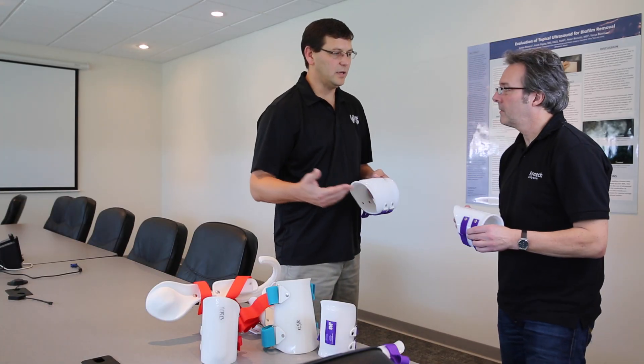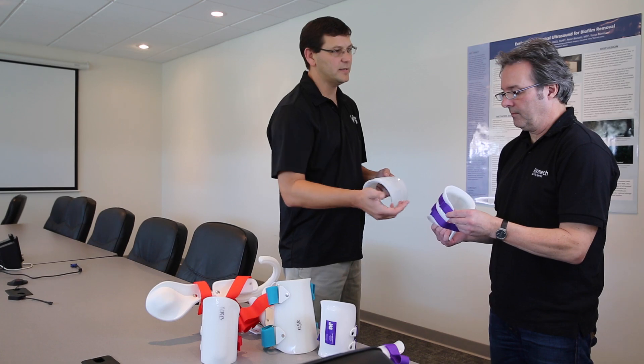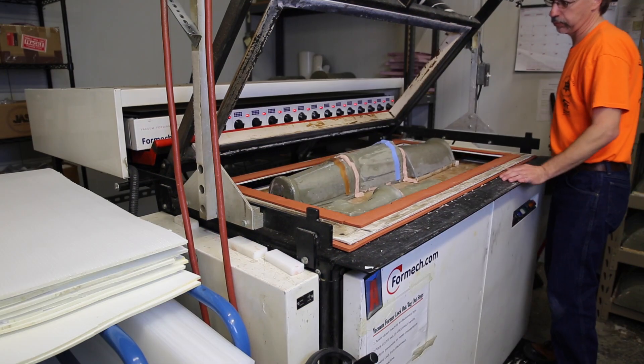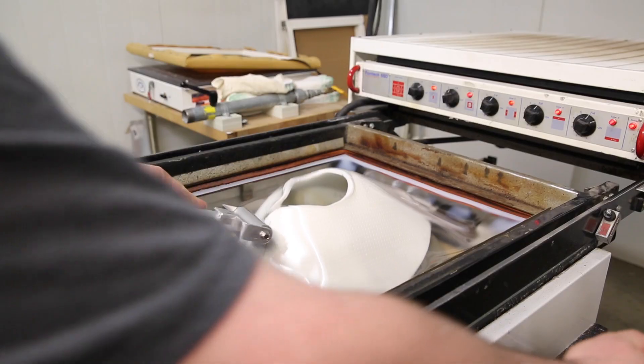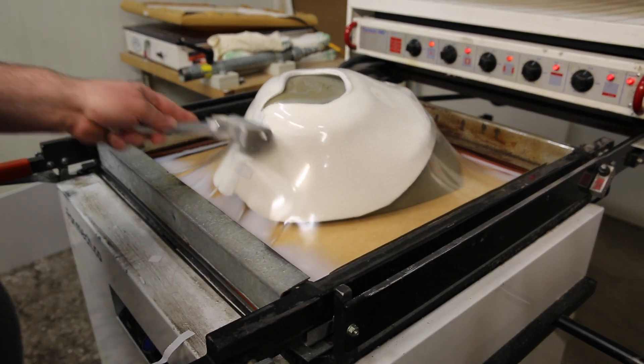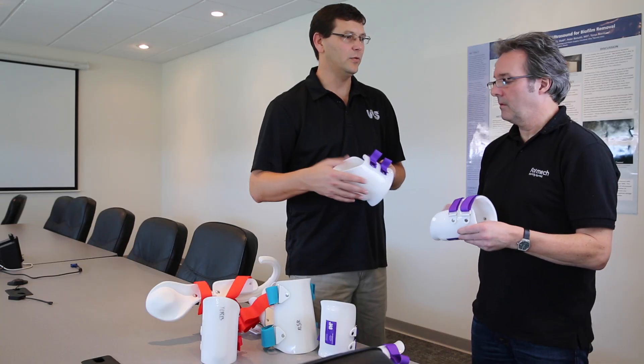Their measurements also tell us if we need to cut off a cuff and customize it, make modifications to it, or we can even make modifications onto the mold whenever they're vacuum formed. Vacuum forming is one of the most important parts of our product's development, formed on the Formech vacuum forming machines.